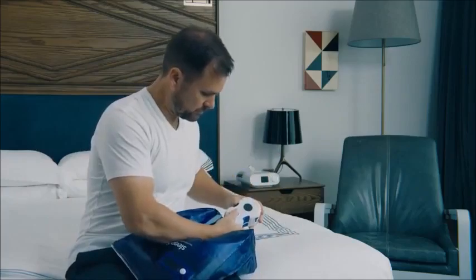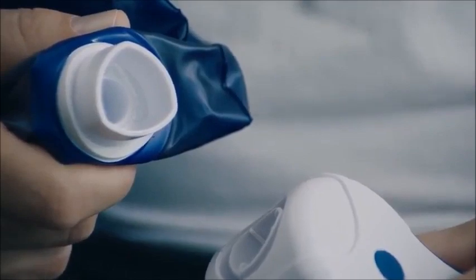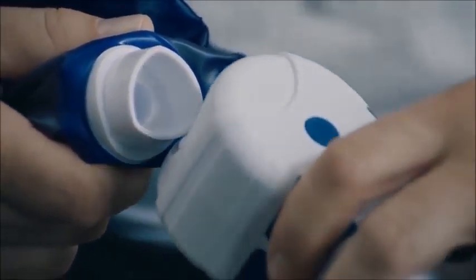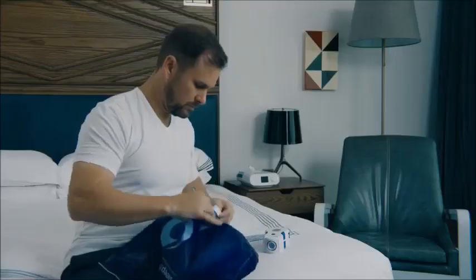Next, you'll need to connect the Sleep8 device to the outside of the bag. On the bottom of the bag, find the triangular valve. You'll see a notch that lines up with a notch in the port of the Sleep8. Slide the valve into the Sleep8 port. It should be a snug fit.